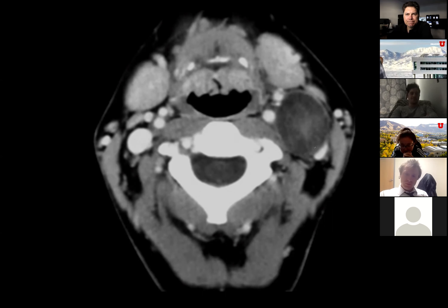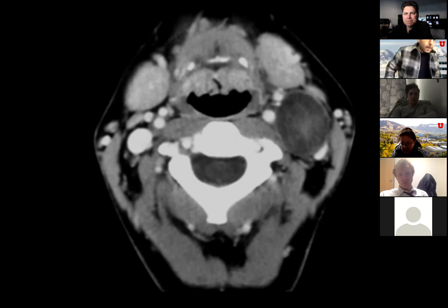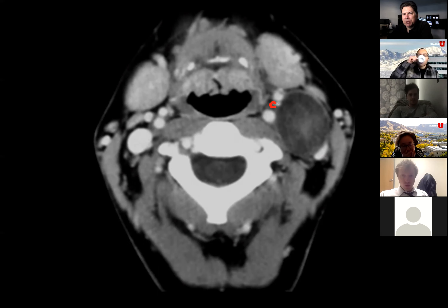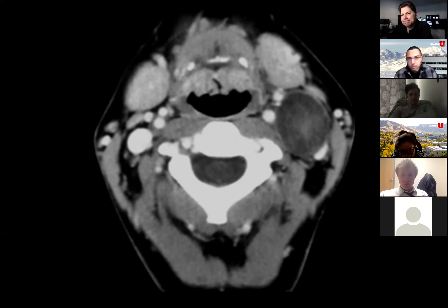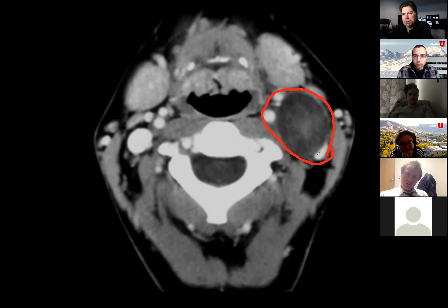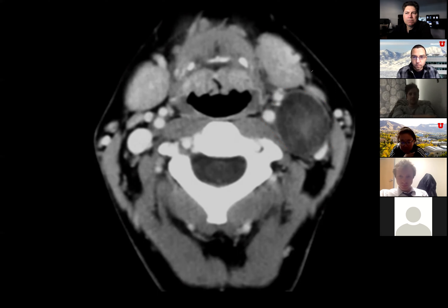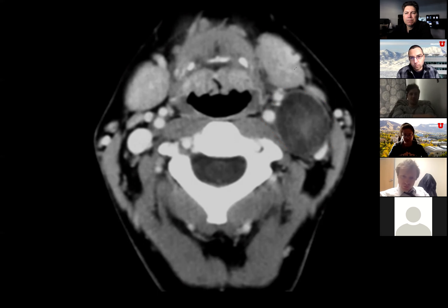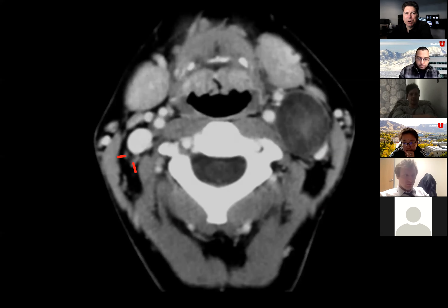This doesn't look like the classic paraganglioma or carotid body tumor. Why not? It's not splaying the internal and external carotids — you'd expect a carotid body tumor to be centered in between the ECA and ICA. What we think about is the carotid sheath or space, because it's actually in between the jug and the carotid vessels.